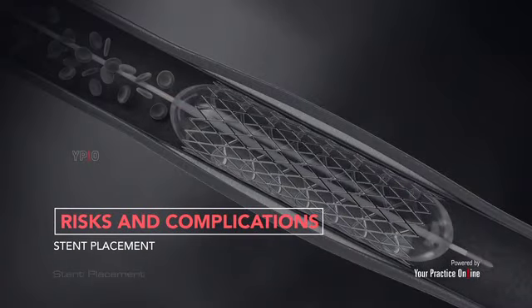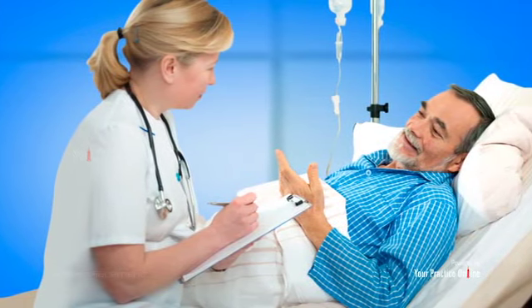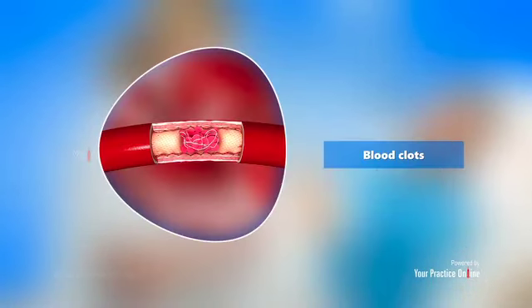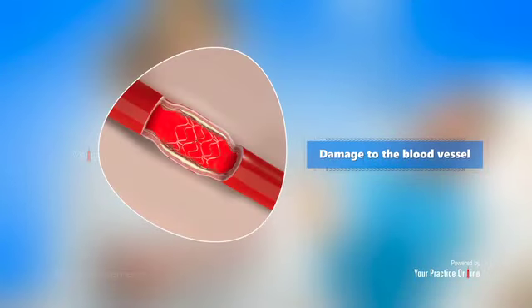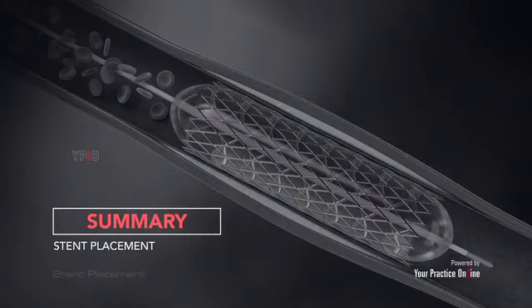Risks and complications. The risks and complications associated with a stent placement procedure may include infection, bleeding, blood clots, re-narrowing of the artery, allergic reactions to dyes or medications used, damage to the blood vessel, kidney damage from the use of dye.